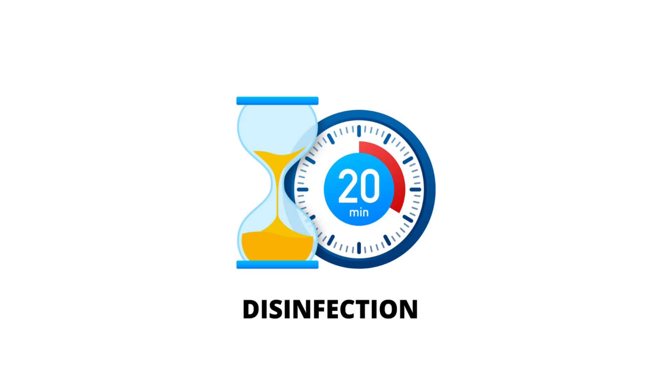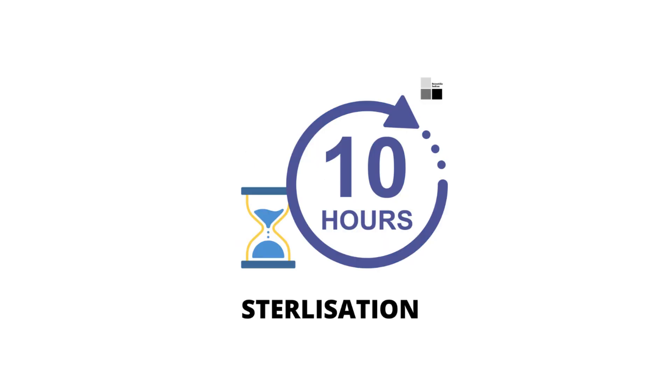After the instruments have been in the solution for 20 minutes, remove them and clean with sterile water to remove the glutaraldehyde from the surface and lumens, flushing all lumens with water to remove the disinfectant. In case you want to sterilize the laparoscopic instrument, the instrument should stay in the activated glutaraldehyde 2.45% solution for at least 10 hours — meaning overnight. After sterilization is complete, the instrument must again be cleaned and flushed with sterile water.